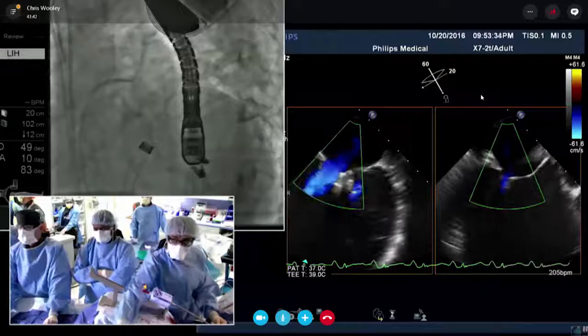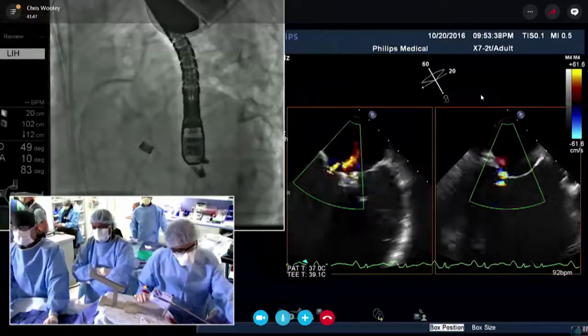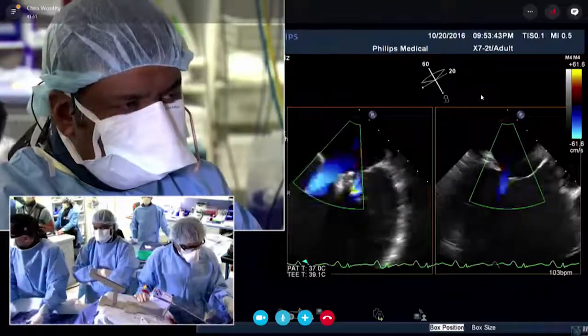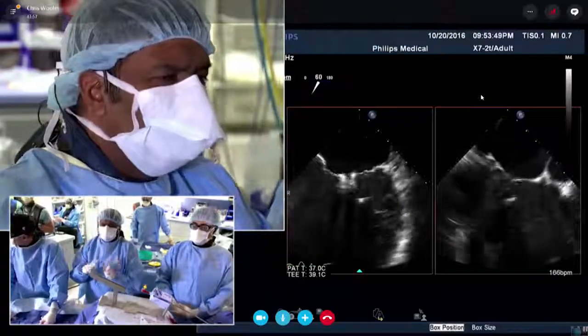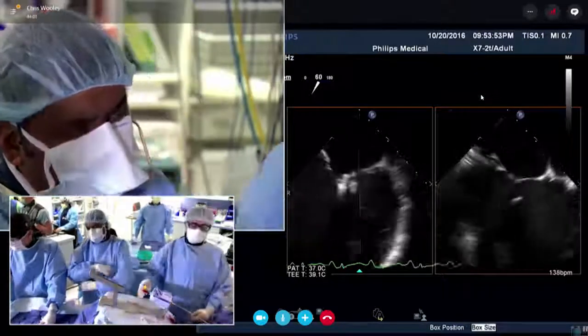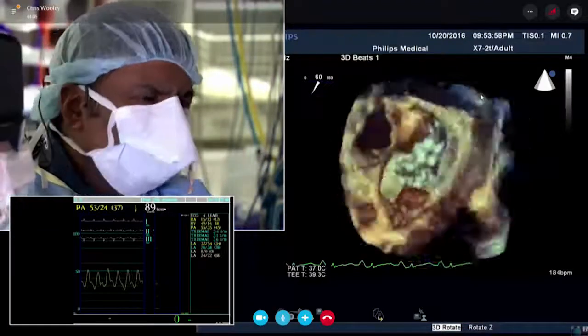I think it's going to be hard to fix that medial jet. Yes, it will be challenging also. And I don't know if the results can be any better than what you have right now. This is a terrific result. When you go on the sides, very medially, very laterally, you get caught in the cord, and actually you can make things worse. So I'm not very interested in putting in a second clip.